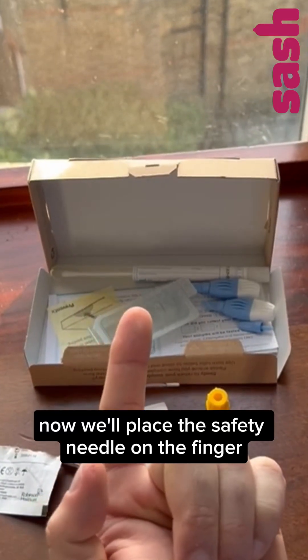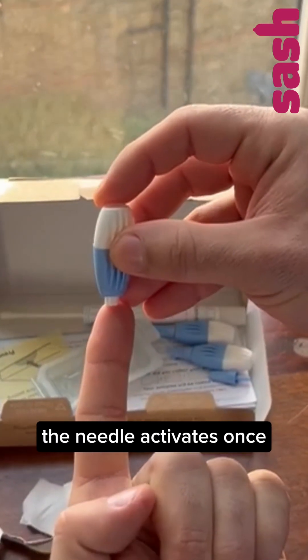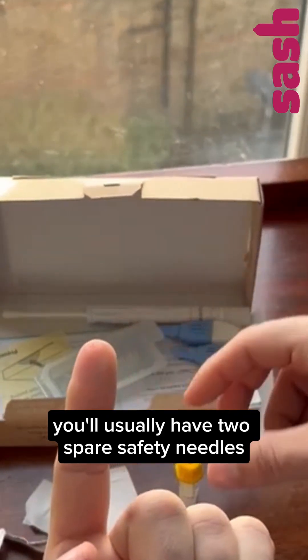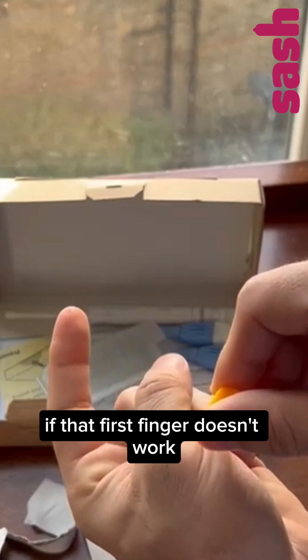Now we'll place the safety needle on the finger and push firmly to activate. The needle activates once. You'll usually have two spare safety needles in case you need to try other fingers if that first finger doesn't work.